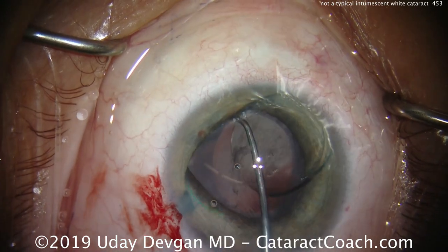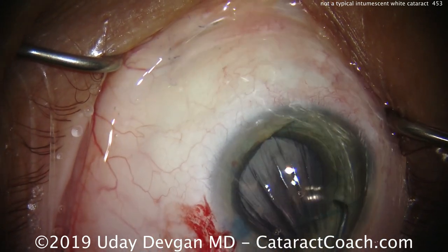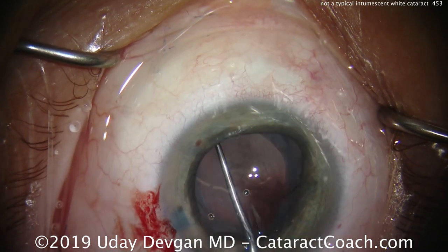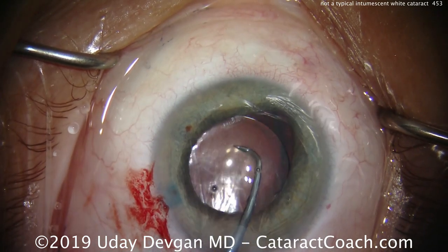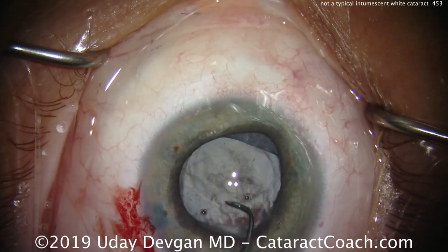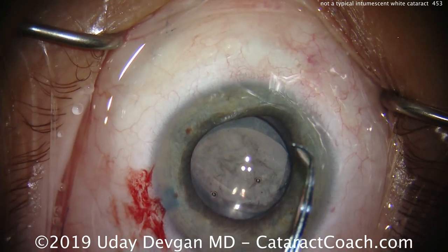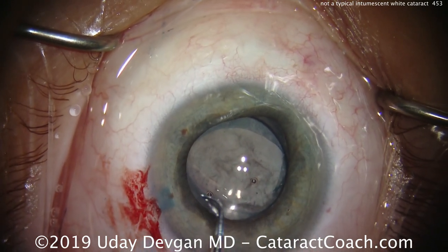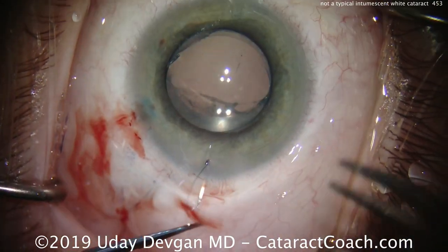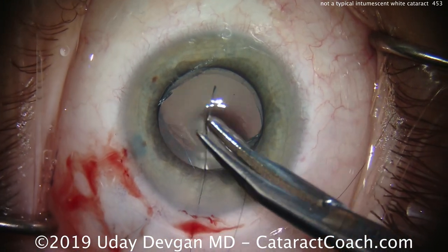We'll use our chopper to dial the lens into the sulcus — dialing that in, getting both haptics into the sulcus. Then we'll dial in the second haptic and bring the lens around to repeat the process, having the entire lens in the sulcus. Once we're happy with positioning, we'll get the optic and put it underneath the rhexis. The rhexis went from a round shape to a more ovoid or diamond shape. The optic is now captured behind the rhexis and the haptics are in the sulcus — that's a very secure position.